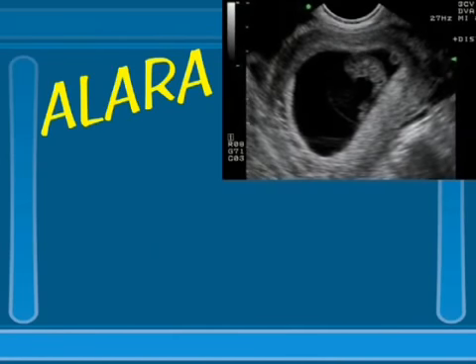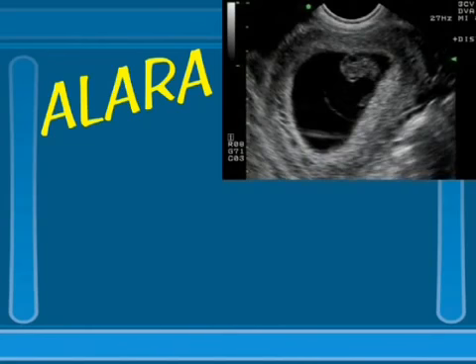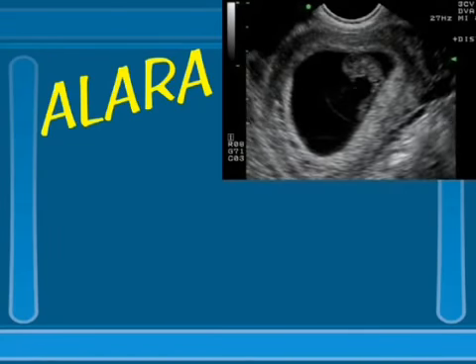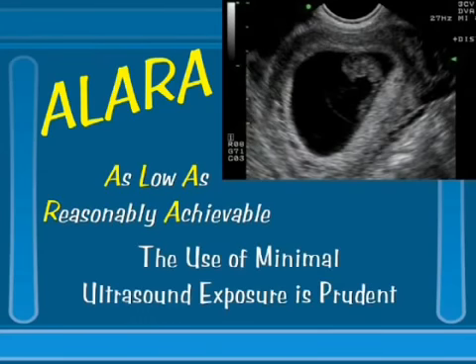The concept of ALARA is important. We use as little ultrasound exposure as is necessary to get a good image. ALARA stands for as low as reasonably achievable. We use just enough ultrasound to get the images that we need.